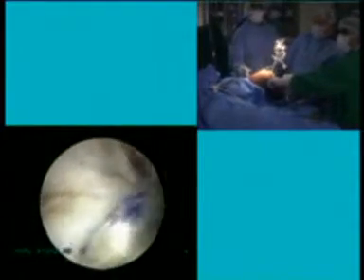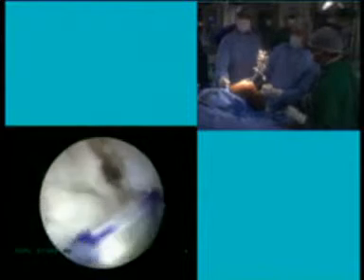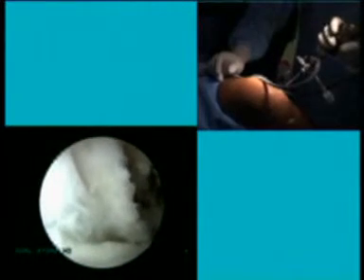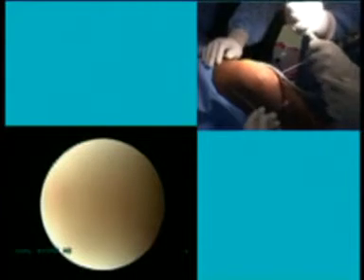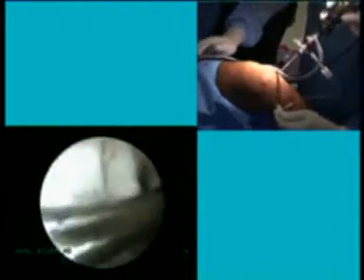Okay, now I flip. It's a flip tag. Do you take the quadriceps with the bone plug or without the bone plug? With bone plug. And where do you keep the bone plug? At the femur side, and at the femur side I do a press fit fixation. Outside in? Dr. Peterson, is it a press fit fixation outside in? It's a press fit fixation inside the joint.